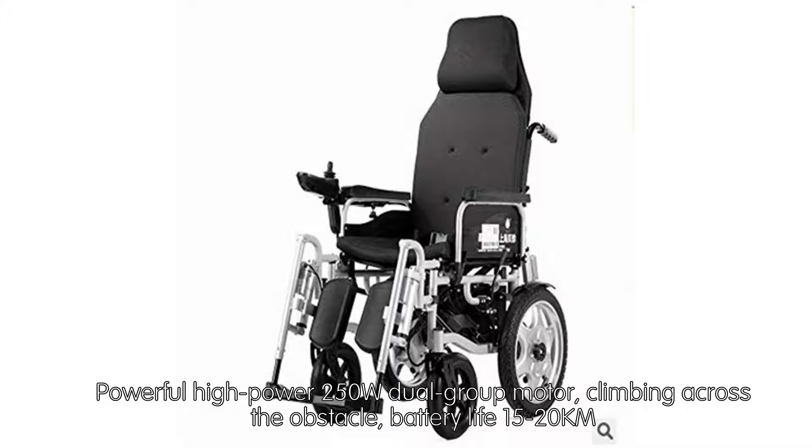Powerful high-power 250W dual-group motor, capable of climbing across obstacles, with a battery life of 15–20km.